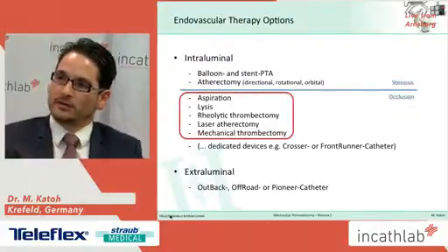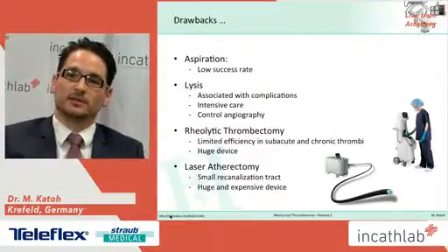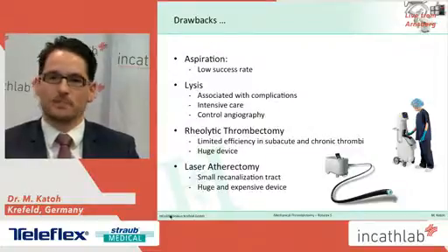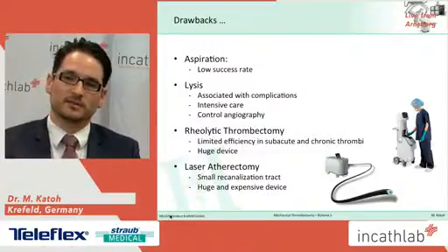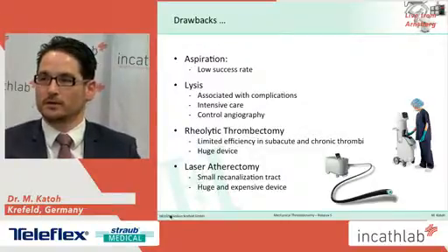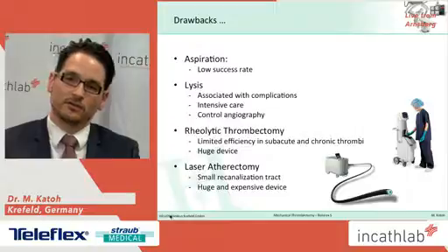And I want to go a little bit into detail. In our experience, aspiration is limited due to low success rate, particularly in elderly thrombi or in occluded vessels with a huge amount of thrombotic material. While lysis is associated with complications like bleeding. All patients therefore have to be monitored on an intensive care unit, and angiographic controls are mandatory.